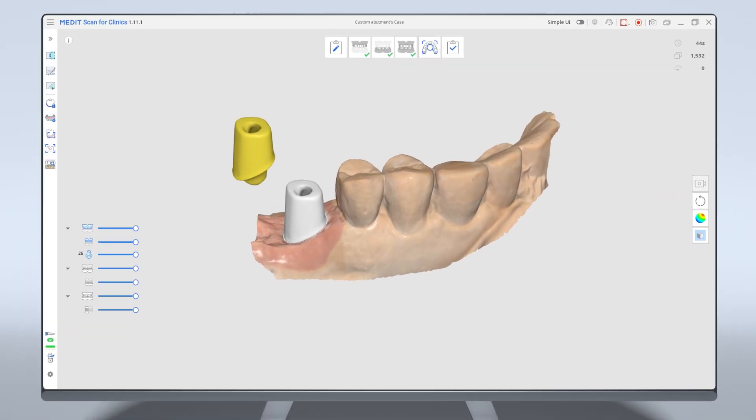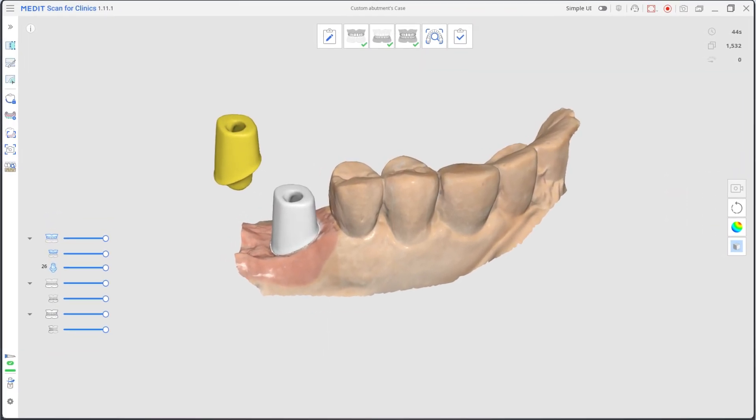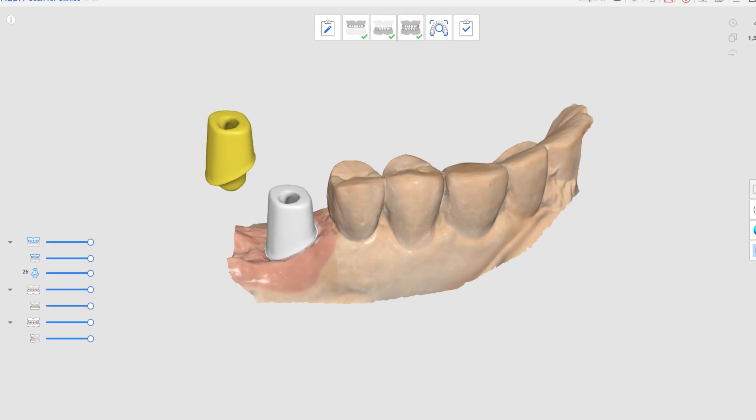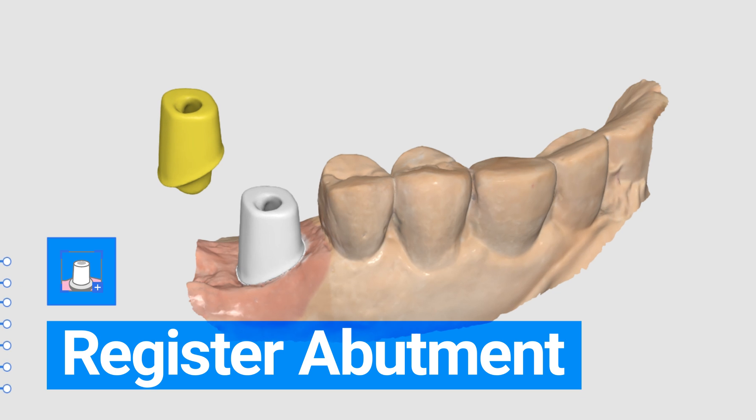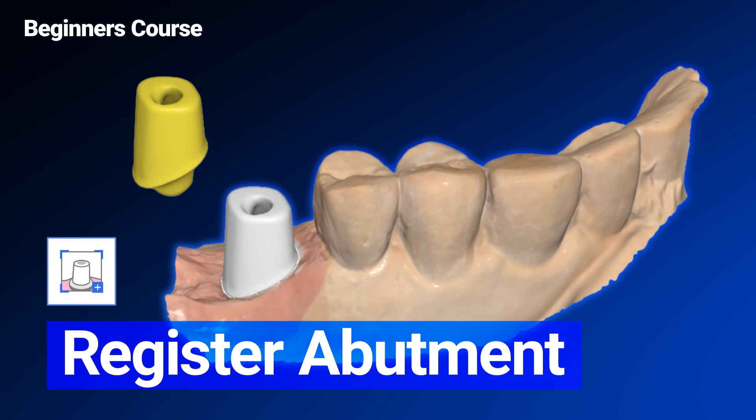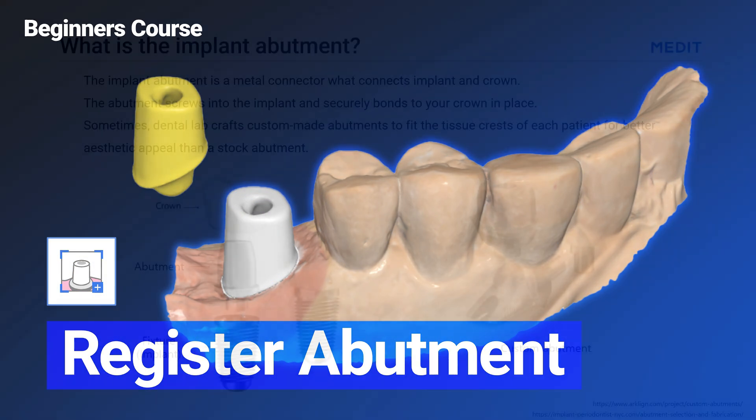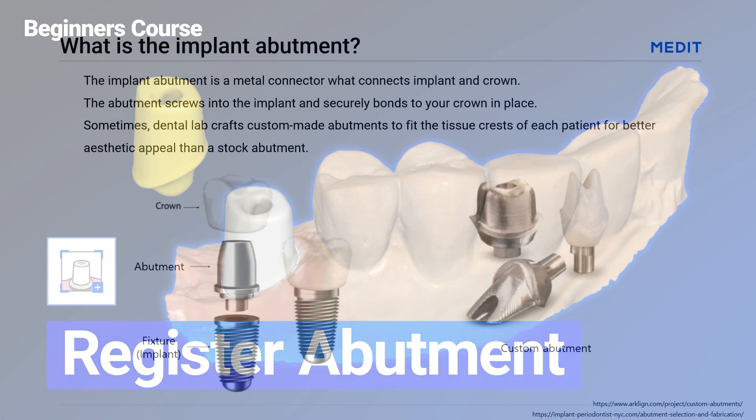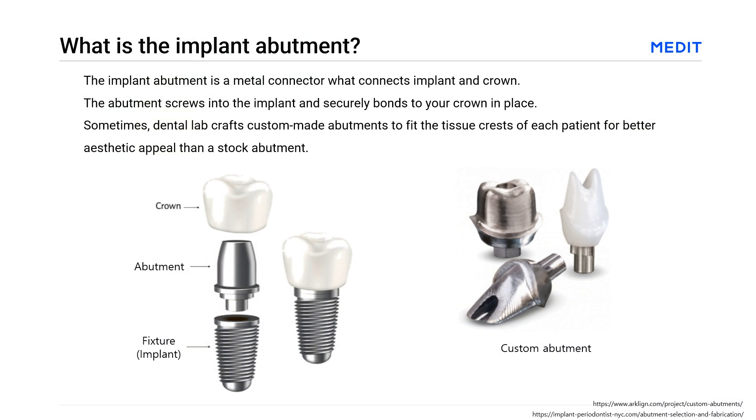This is a quick demonstration on how to scan and register a custom abutment and send it to your lab. First, the implant abutment is a metal connector that connects the implant and crown.